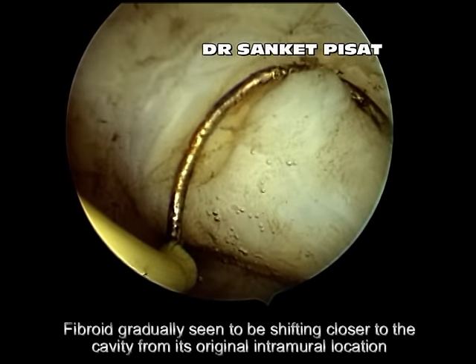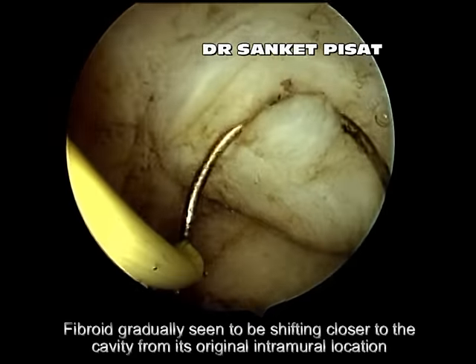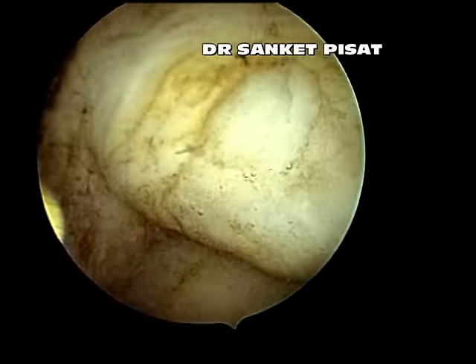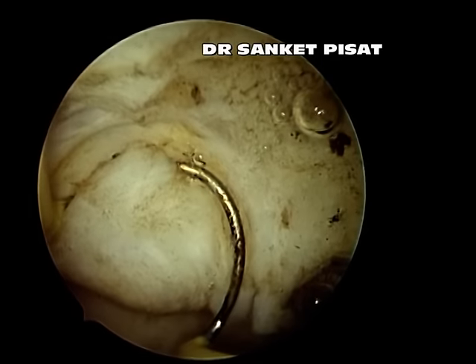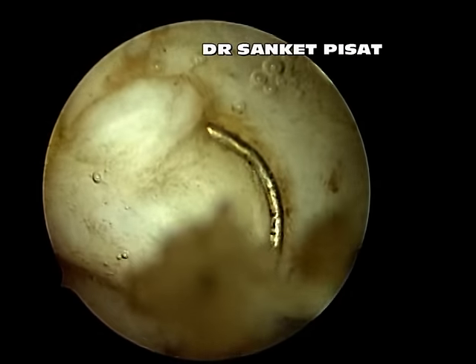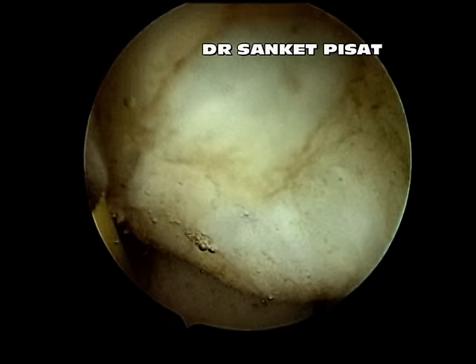By this gradual pushing and pulling, the fibroid is seen to shift closer to the cavity from its original intramural location. This process is meticulously continued until a deep intramural fibroid is converted into a more submucous one.